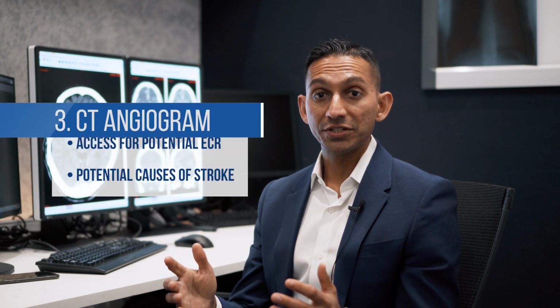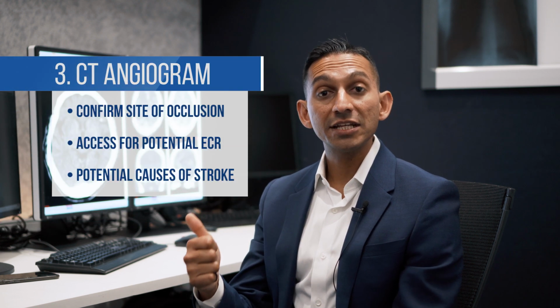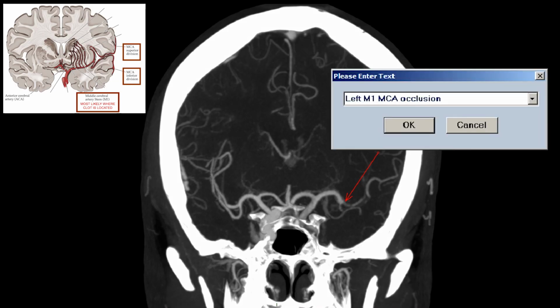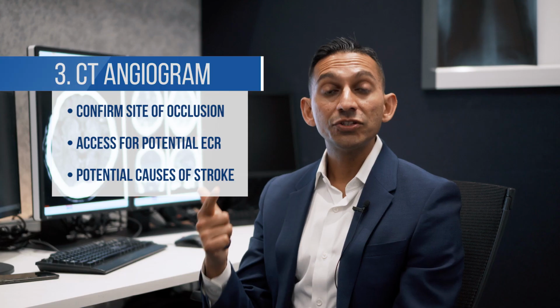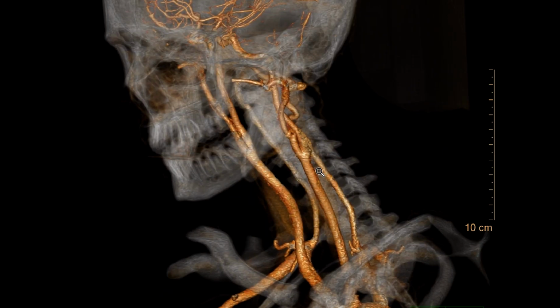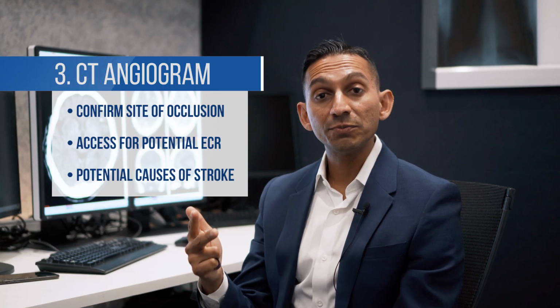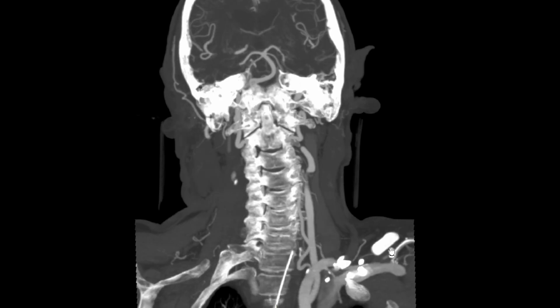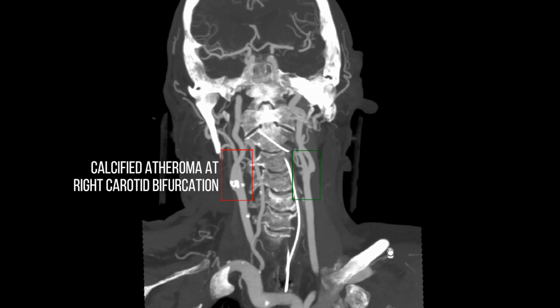We then use the CT angiogram for 3 main reasons. Firstly, to confirm the site of occlusion as suspected on the CT perfusion, to assess the access for potential endovascular clot retrieval, and finally, to assess for potential causes of stroke, such as atherosclerotic disease or arterial dissection.